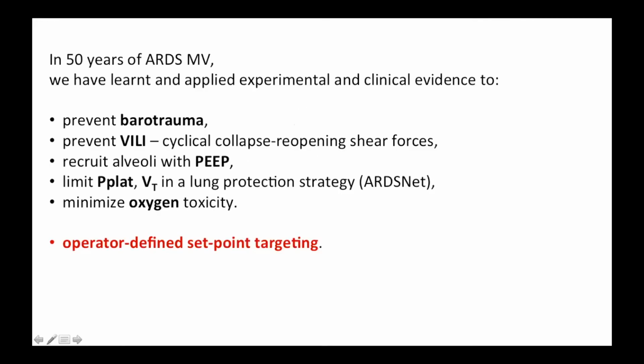In the last 5 decades, 50 years of ARDS mechanical ventilation, we've learned and we've applied a lot of experimental and clinical evidence. And as a summary, these have enabled us to prevent barotrauma and prevent ventilator-induced lung injury, such as occurs typically with a cyclical collapse and the reopening shear forces.